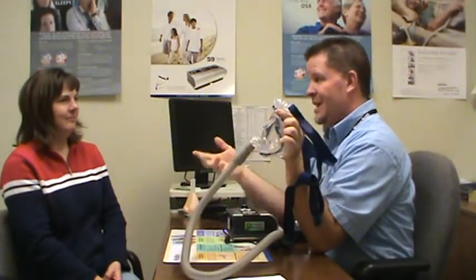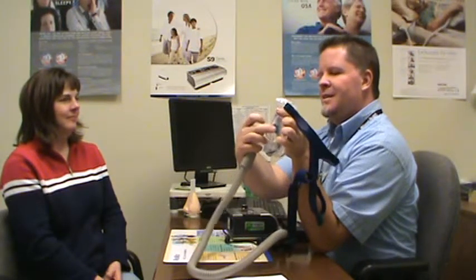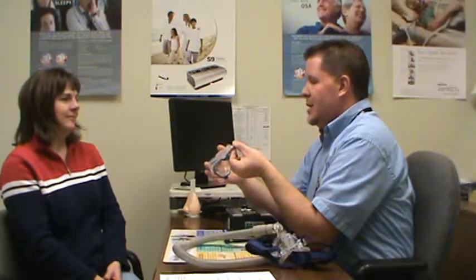Our next option, on the front of the mask, there's two tabs, one on each side of the mask. You can see that there's slots, indicating that your fingers should go there at some point. If you put a finger on each of those tabs, pinch in, and push, you can take that silicone seal right out of the mask. Now, the reason for that is for cleaning. The manufacturer suggests that you clean it once a day. It's good to do it at the same time every day. Make it a routine and a habit. You want to use a mild hand soap or dish soap, something that won't scratch that silicone, as that will affect the seal to your face.